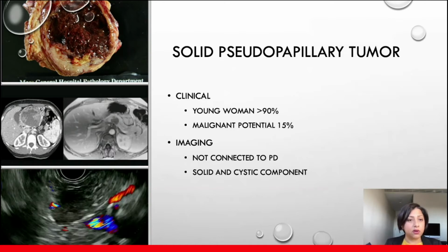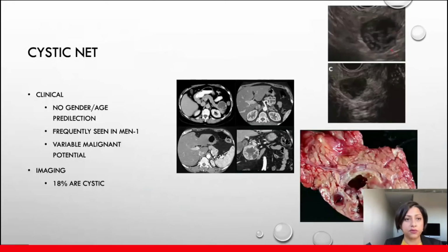high on the cards. So on the left here, we have an EUS image of one of my patients, a young 24-year-old woman who had this cyst incidentally discovered on a CT scan done for investigation of kidney stones, and EUS and biopsy confirmed the diagnosis, and she went off to have surgery.